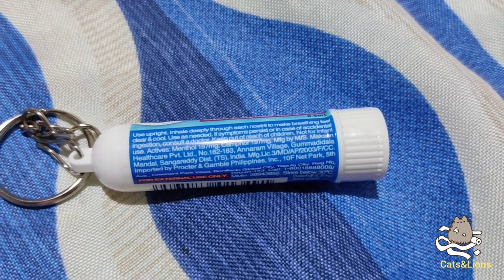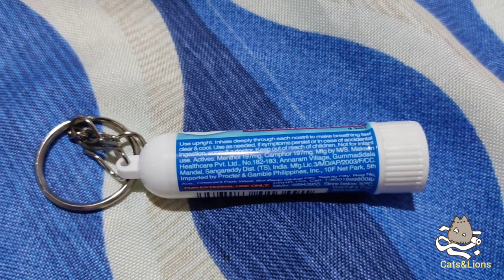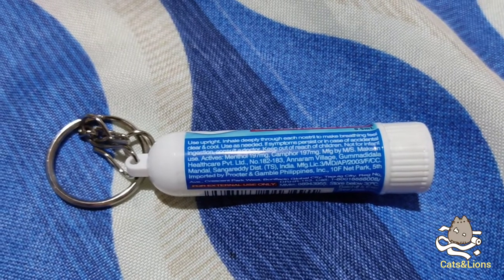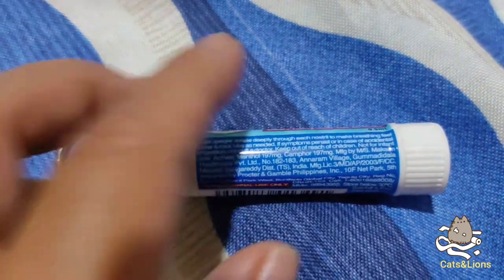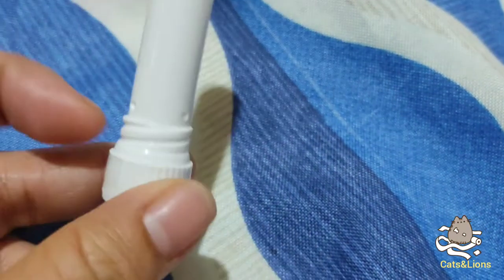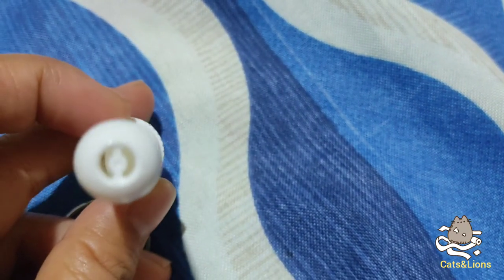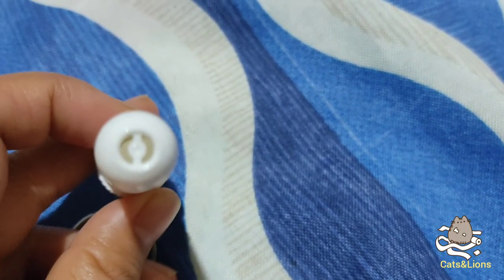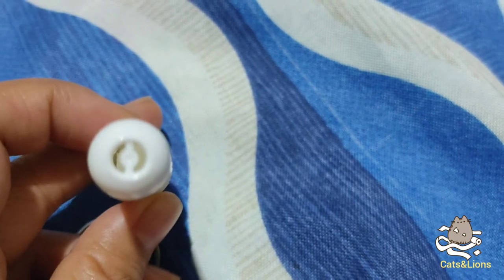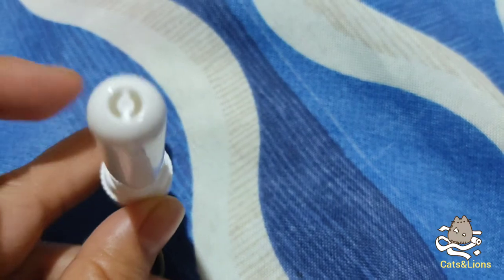It also says that this Vicks inhaler is not recommended for use by infants — that's children 0 to 2 years of age — because the sphere inside containing the medicine can break, and if accidentally inhaled it's going to be really painful. I'm not sure if you're seeing that sphere, but at the bottom of this tube there is a sphere of medicine which is mobile inside the tube.